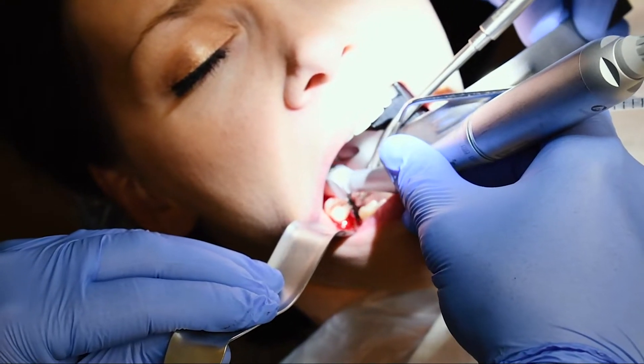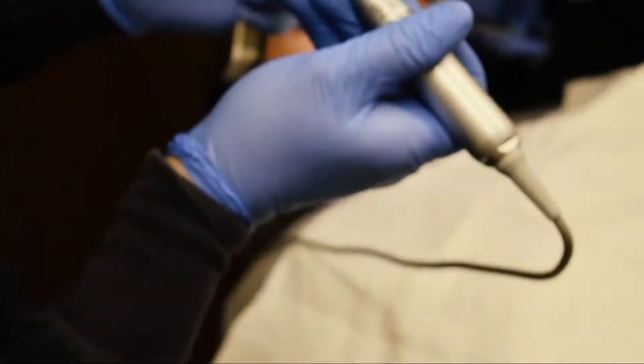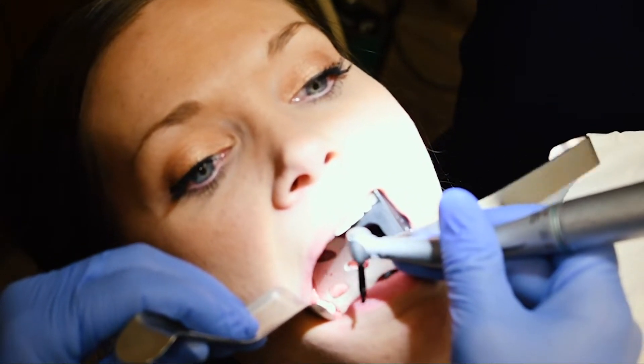Three, here's five millimeters. When you let go of this it'll be 5.0 by 10. Yes please — go ahead and open the implant.